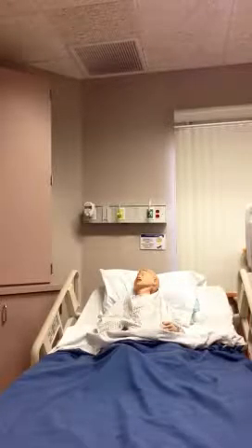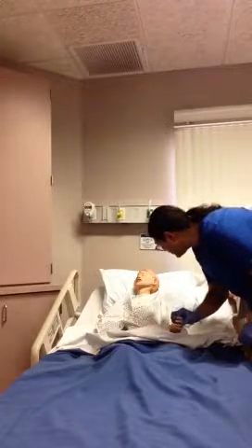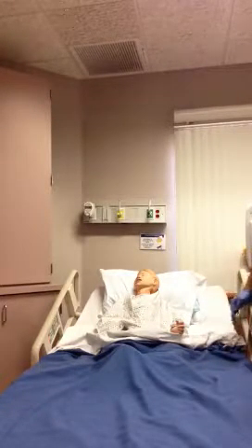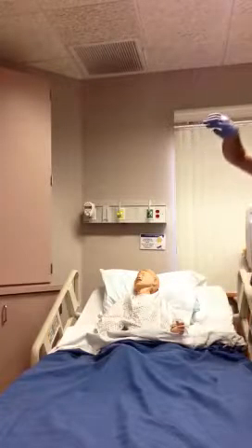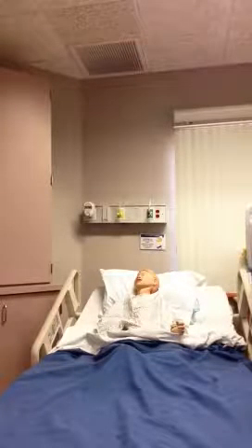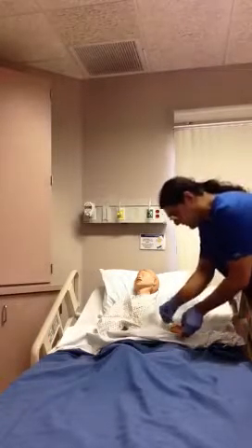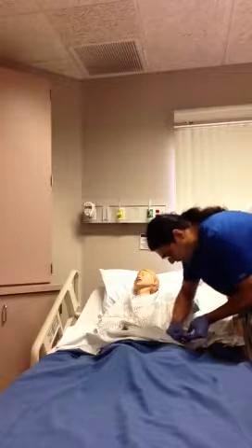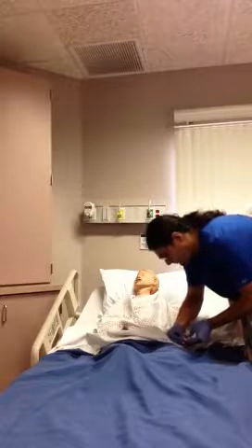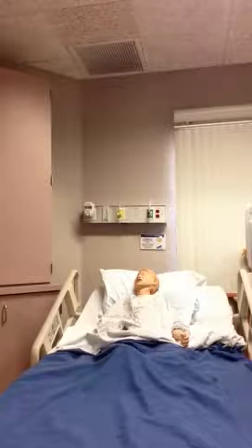Okay. I'm going to inspect the patient's fingers. Do you have a finger, a site that you prefer to have your sugar checked on? Okay. If I saw any infections or anything, a finger that's chewed up, any bleeding, anything where it seemed like it would be inadvisable to use that site, I wouldn't use it. Otherwise, I would go by a patient's preference, and if they didn't have a preference, I'd choose a reasonable site for them on the finger here. Go ahead and wipe the finger and wait for the alcohol to dry, using the ring finger, because I guess that's the site we're using today.